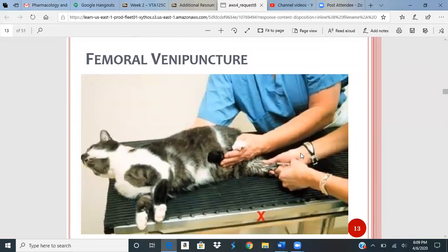So of course you can't see it here, but we're doing that stretch. We've got the forearm, making it so they can't back up. They're scruffing, but not too hard because, like I said, you don't want to see their eyeballs go back. And then bringing the hand down gently to put some pressure on that vein, and then this person's drawing the blood.